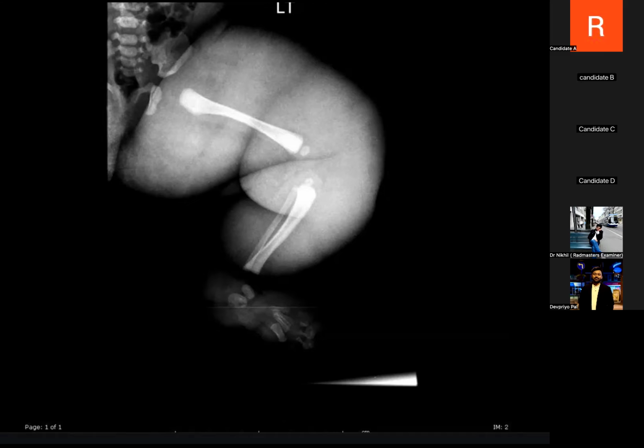So you told me you're thinking about vascular lesions. What are the different categories or classifications of vascular lesions? It could be an arteriovenous malformation, venous malformation, or lymphatic malformation. What are the clinching diagnostic factors that you see on ultrasound that can help you favor either direction? It depends on the flow. If it's a high flow, it could be an arteriovenous malformation. If there's only venous flow, it could be a venous malformation. If I cannot see any vascularity at all, it could be a lymphatic malformation.